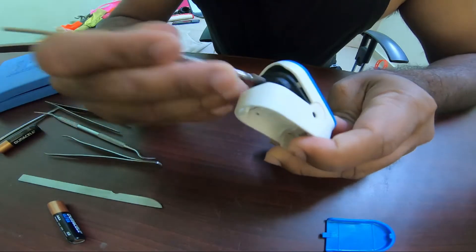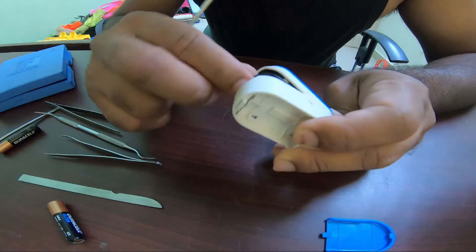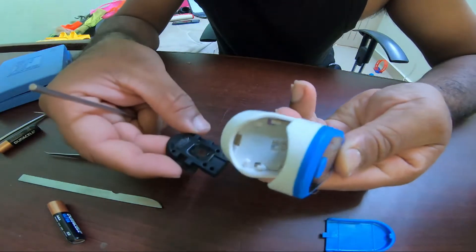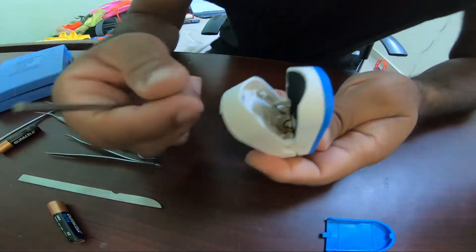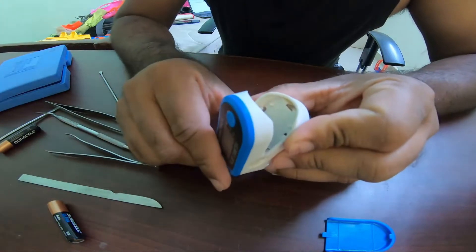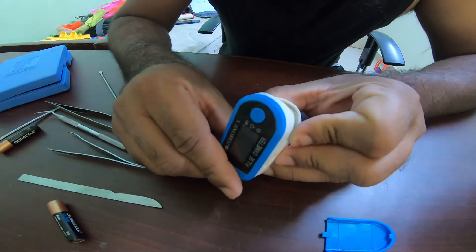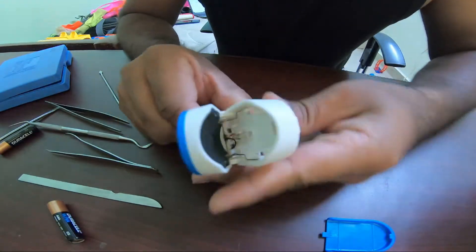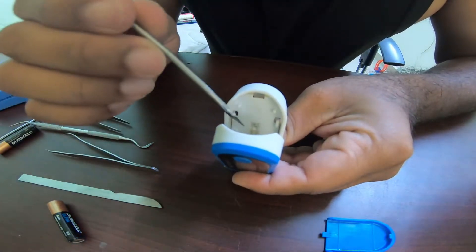It's not rocket science — just take it off, it comes off just like that. Keep it here. I find the black wire and the yellow wire are disconnected.